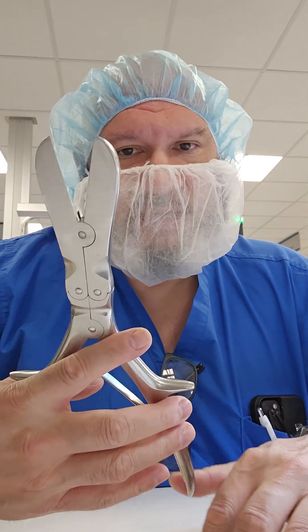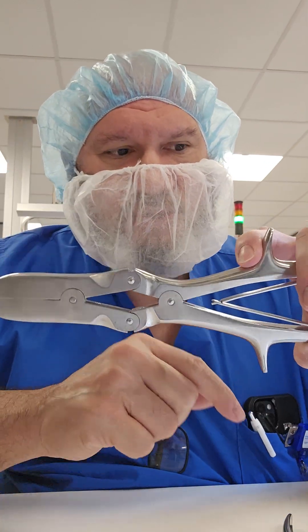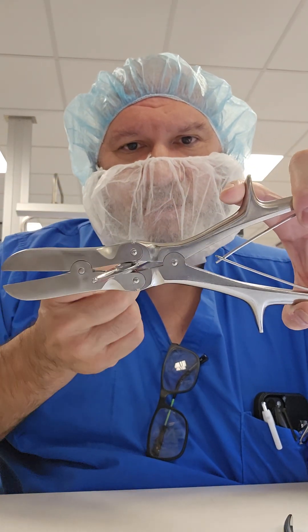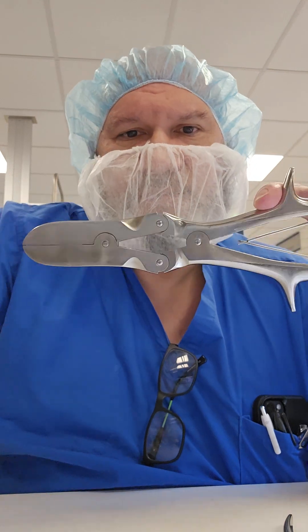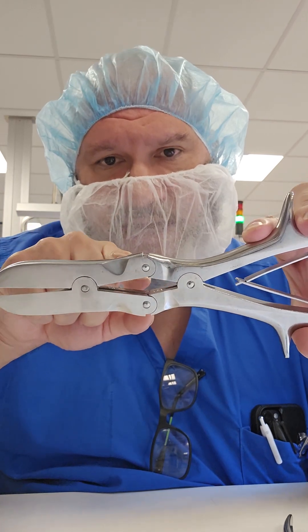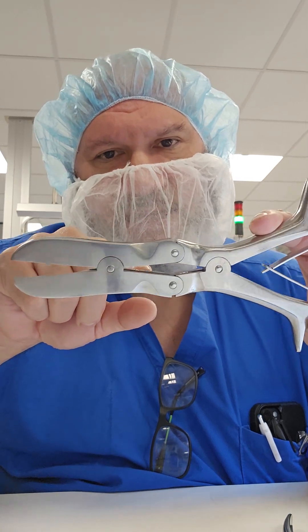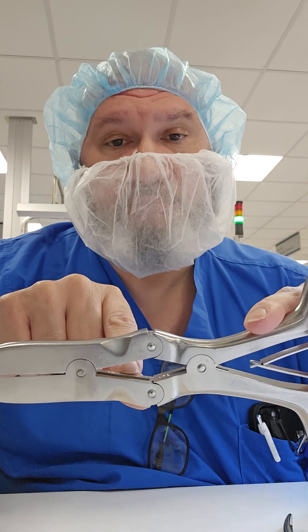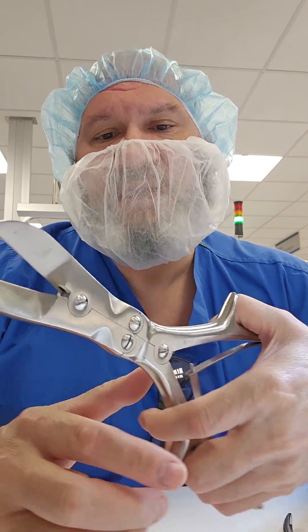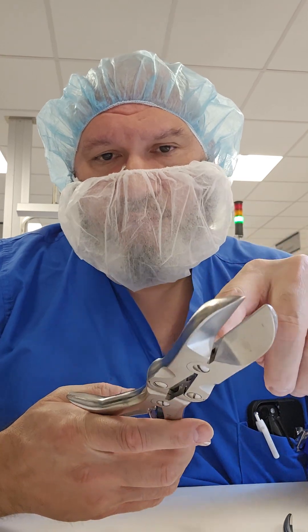When sending these through decon in the washer, it is very important to keep these instruments open. They sell specific devices to keep your instruments open — do not use another instrument to prop it open, as you can damage it. Use those specific devices so you can get in there and clean manually and then place it through the automatic washer with the instrument slightly open to remove all debris.